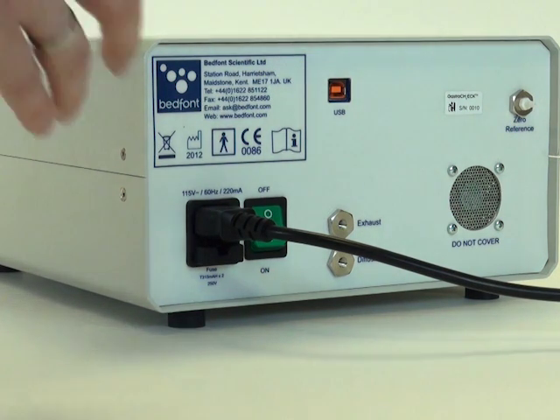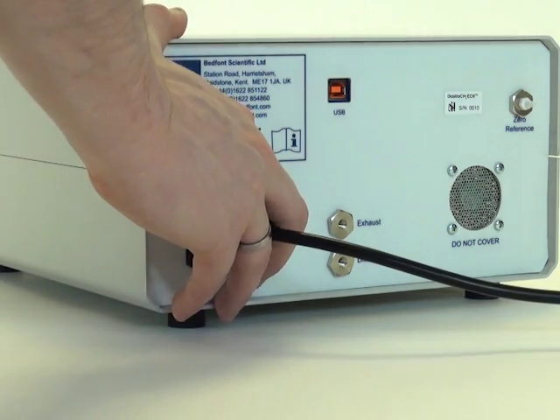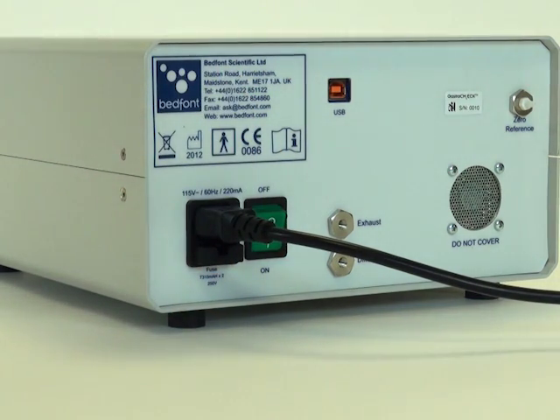To switch the monitor on, reach around the back and press the on-off switch. The monitor will need a 20-minute warm-up time before use.